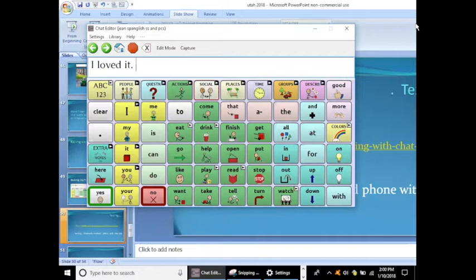Okay. So there's my whole conversation that I had with Mona, right? And it's just all there. It pairs totally with my phone. And here's the reply. So I can hit reply and it instantly goes back. And it says enter the text to send to Mona.